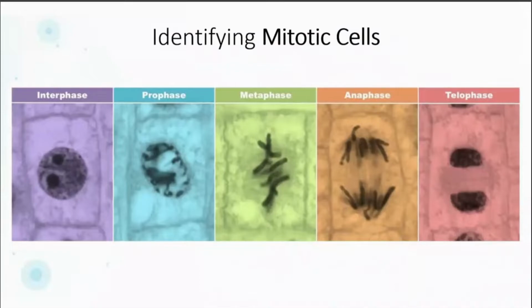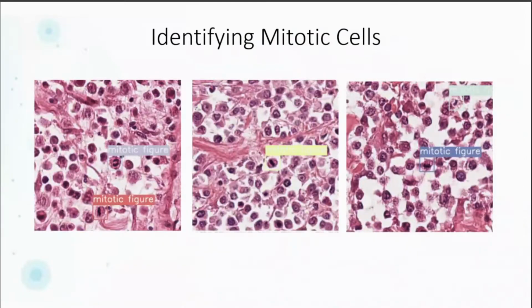I haven't done biology since then, but you may recall the phases of mitosis, and I love this visualization just to give a quick illustration of what steps the cell goes through as it is undergoing the mitotic change. And I show that because what the pathologist is trying to do is recognize and determine those stages in this digital representation of the tissue sample.